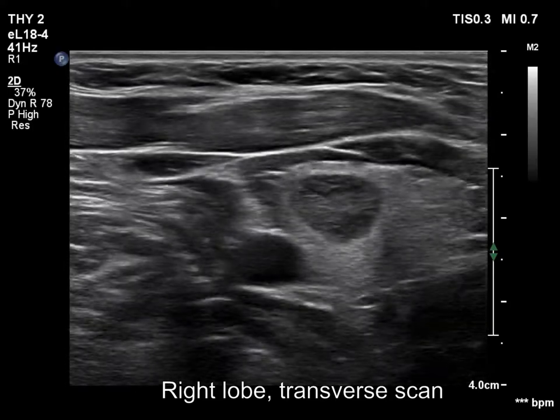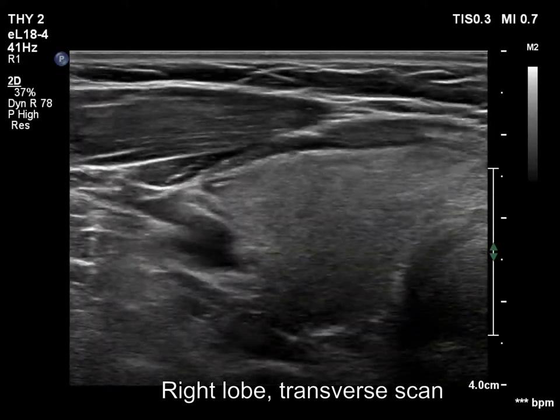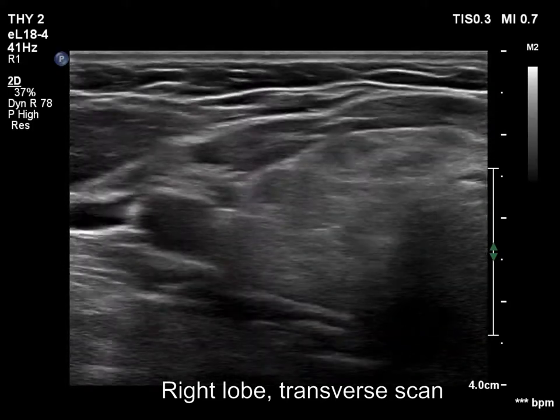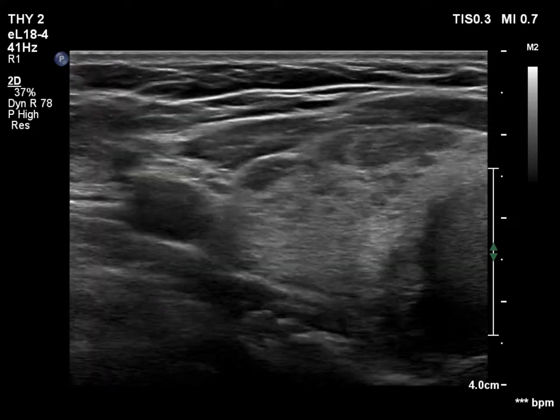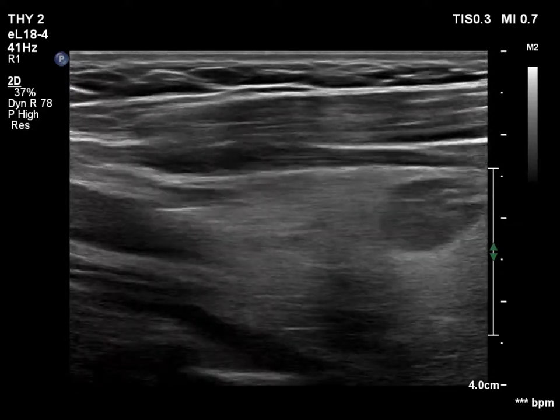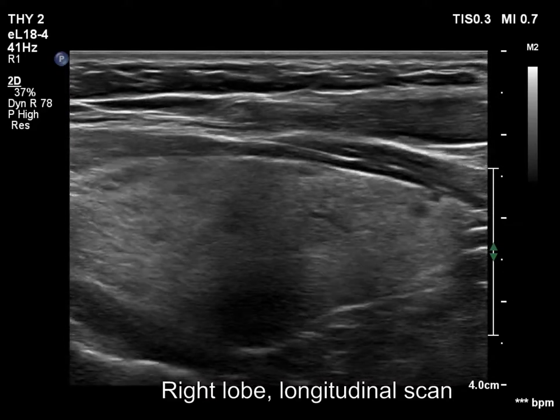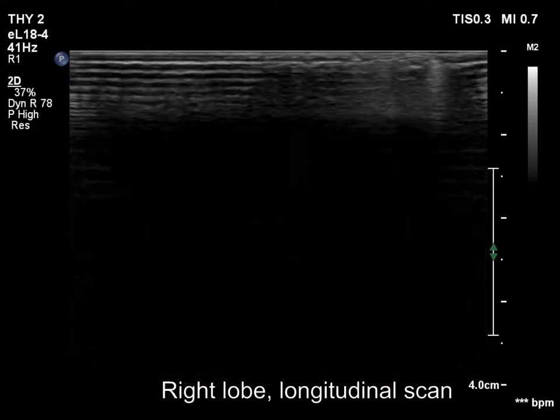The thyroid is heterogeneous and has numerous discrete hypoechoic areas. Most of them are clearly presentations of thyroiditis.